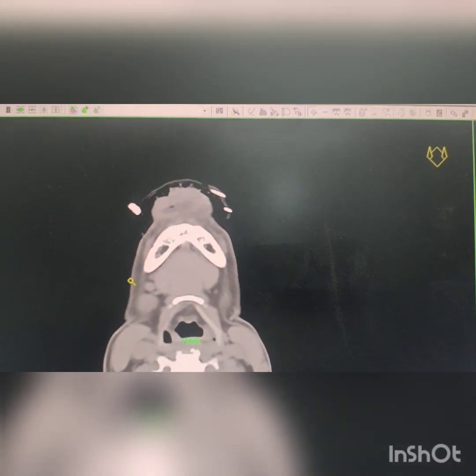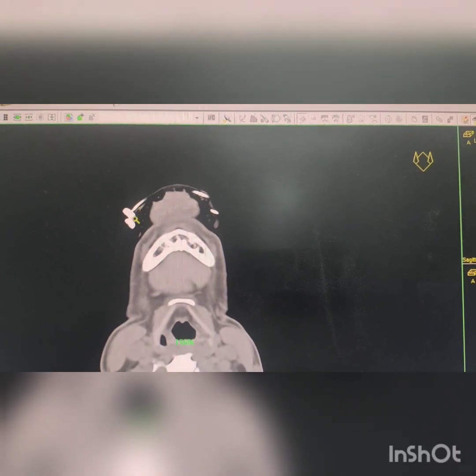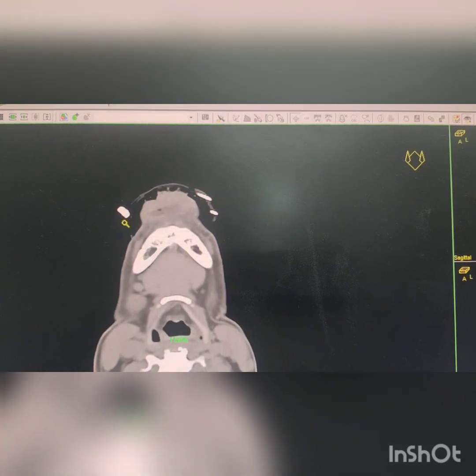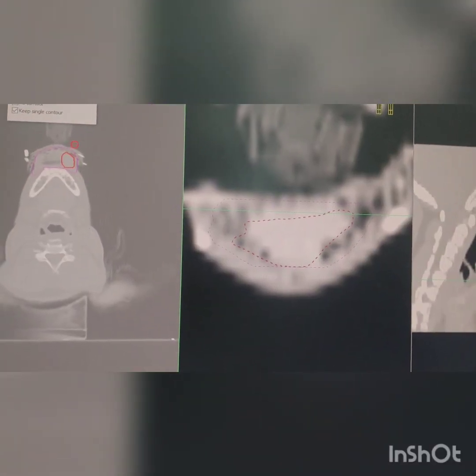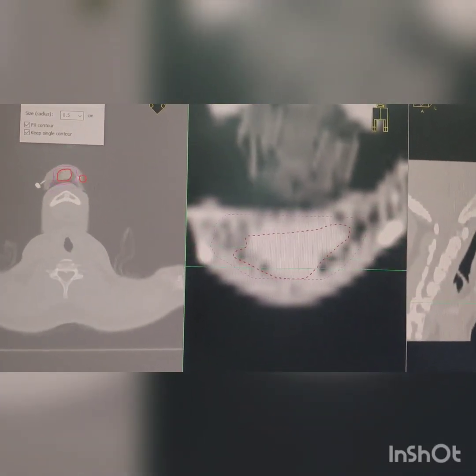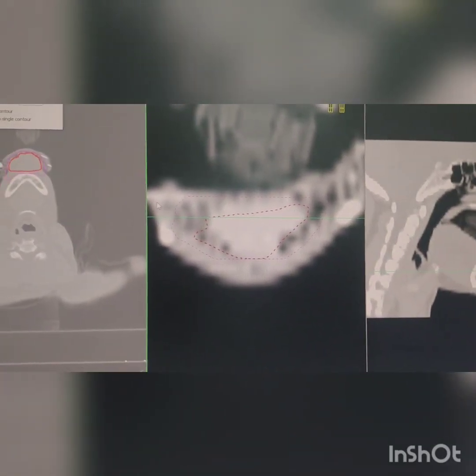This is the CT scan — you can see all things are there and you can contour. This is the first catheter, this is the second catheter, this is the third catheter — we have put three catheters. You can put a copper wire to help identify them. Then control the GTV in all windows; mostly it is the airspace and surface window, but you should also view it in the lung window. You can control it in the axial view.